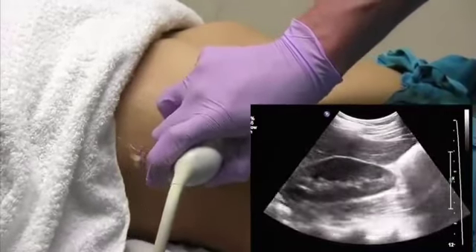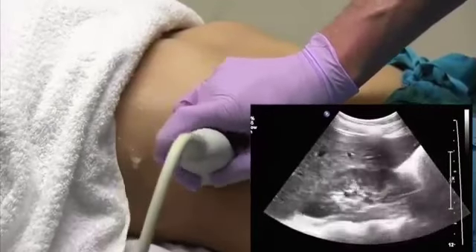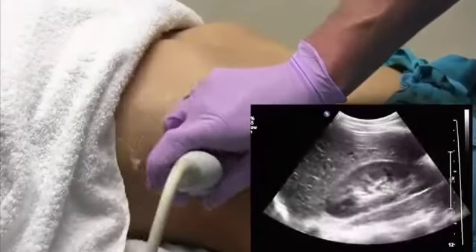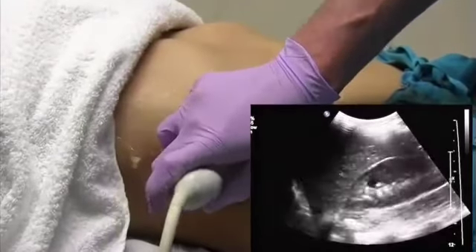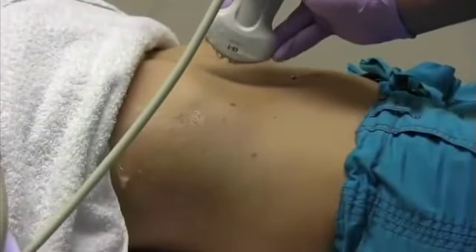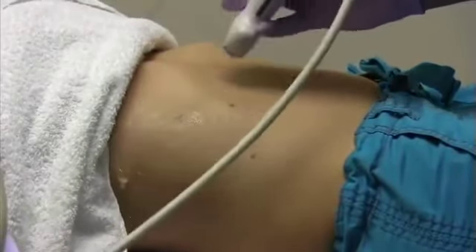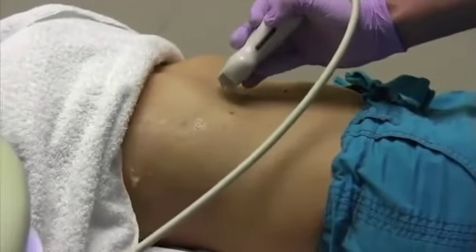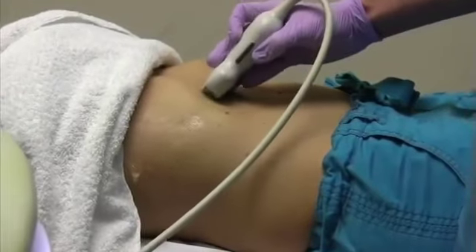The whole time you're going to want to make sure that you're sweeping through the liver completely, just again to make sure you're not missing any pathology here. Next we're going to show you how to image the gallbladder, and you can really use two windows depending on which one works best for the particular patient.